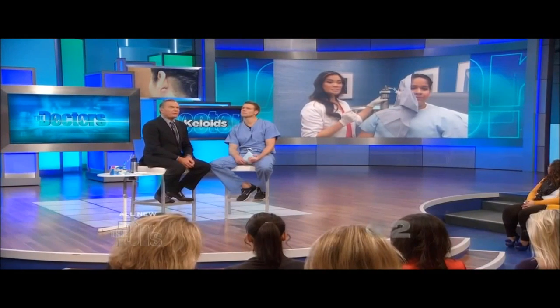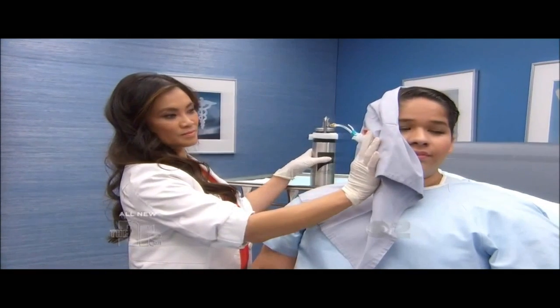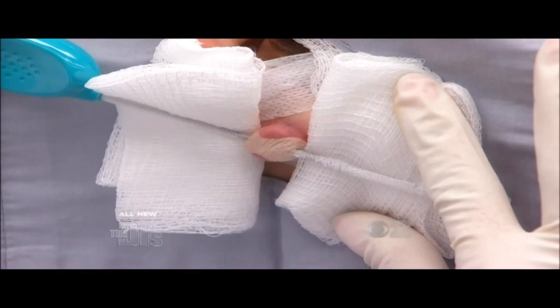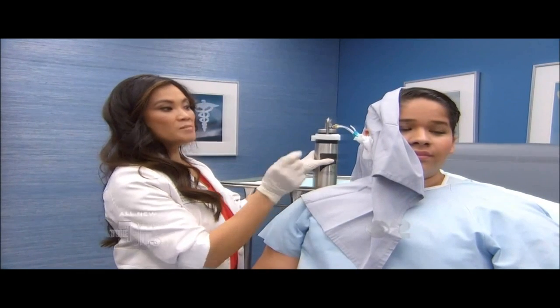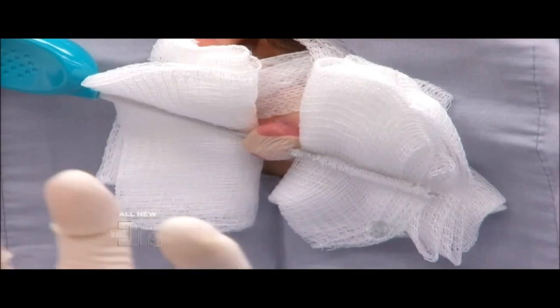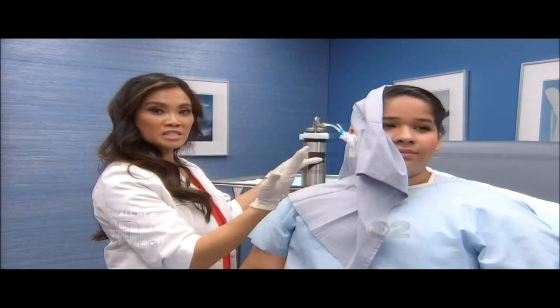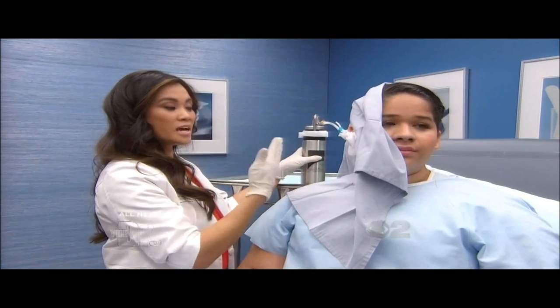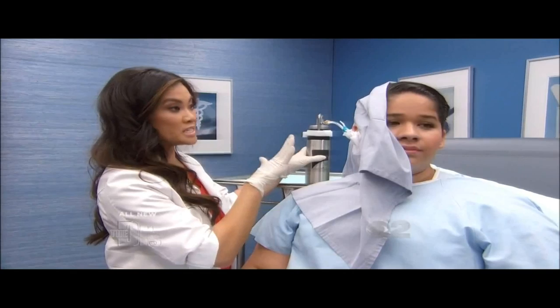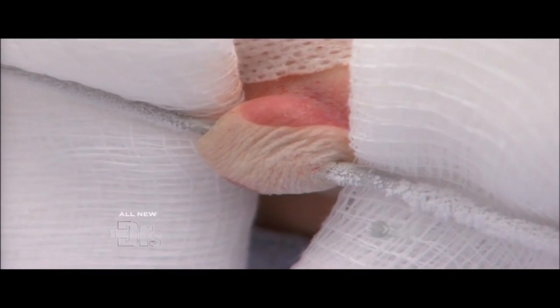And Dr. Lee, you and I both treat keloids all the time, and I'm going to get into some of the other options. But in your hands now, are you really excited about this new type of treatment? Yes, because it's painless. I mean, we put a little numbing there locally, but she does not feel it. And it's really inducing frostbite to the entire keloid. And it really kind of stops right at the edge of the regular skin. It's sort of a heat barrier because there's a different temperature of the keloid than your normal skin. And so it's painless. It usually takes one treatment. I think 97% of patients in a study had no recurrence at 18 months.